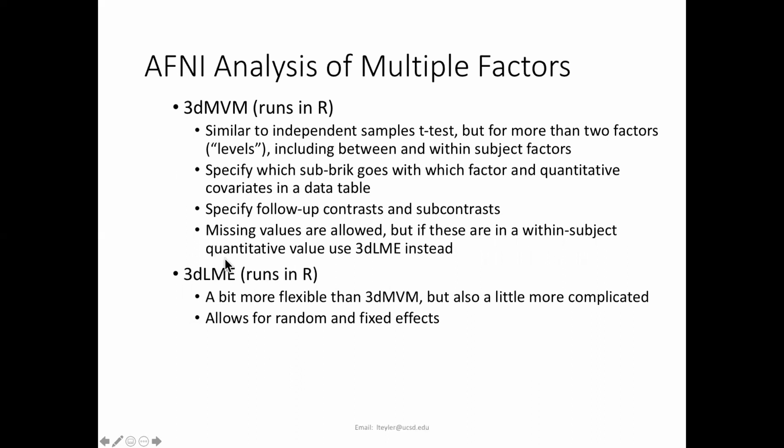Kind of unluckily, for whatever reason, I think for time efficiency, these programs run in R. So you have to make sure that the AFNI package that you downloaded also includes R, and you have all the R libraries that are supposed to go with AFNI, because this one does run in R. And it also means that you have to be familiar enough with RStudio or using R to be able to put the commands into R as opposed to putting them into a Linux command line or Windows command.